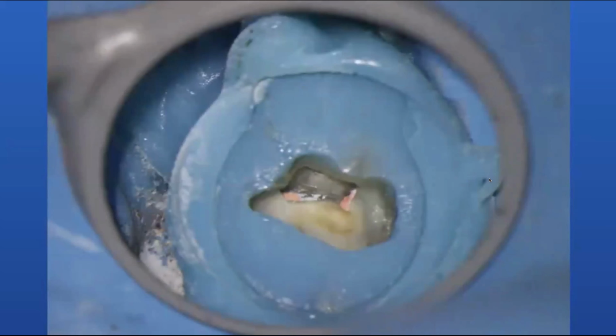Now, this is particular because in the past I was doing quite a bit of this. I'm using the sound seal as a custom resin matrix. So for those of you who are part of TDO, there was a TDOer that had come up with the concept of using green opal dam as a custom resin matrix into which the buildup materials can be placed.